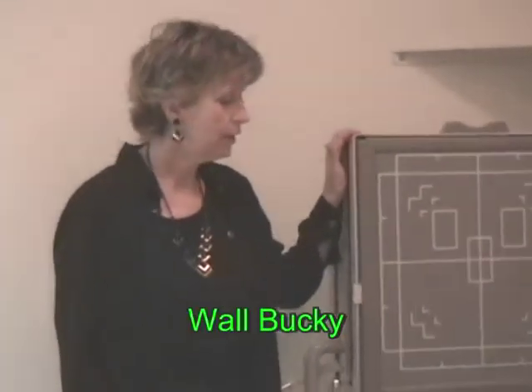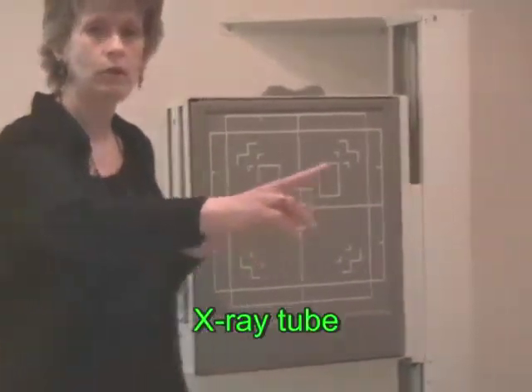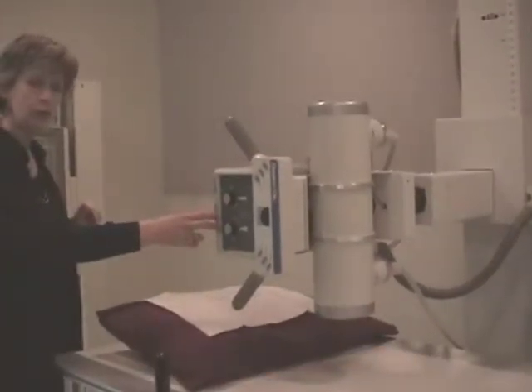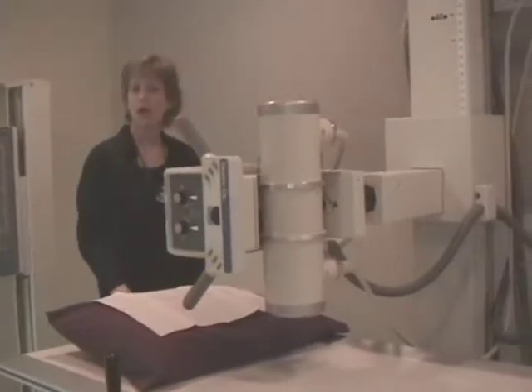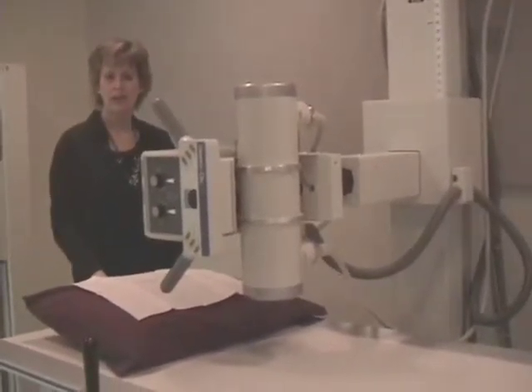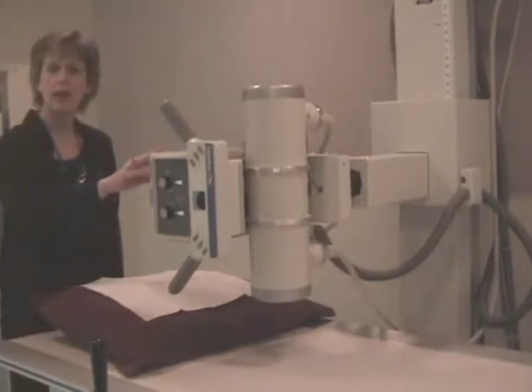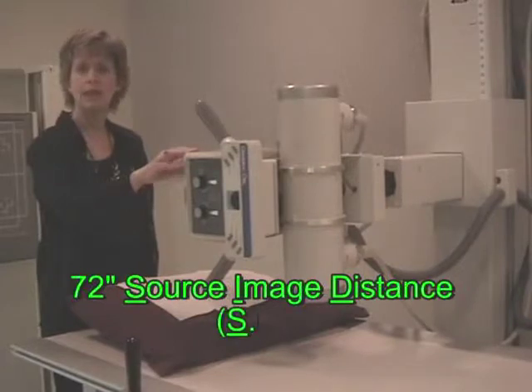We're going to focus on the room setup now. You're going to use a wall bucky. This is a very standard example of a wall bucky. Here's your X-ray tube, and you can't see from the angle of the tube right now, but over on the floor here we have a mark on the floor that will tell the technologist that the tube should be at 72 inches. At 72 inches source image distance, 72 inches SID.